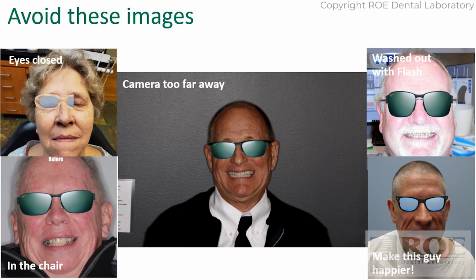Both the top left and bottom left, both the patients are in the chair or lying back. And that just changes the face. It changes because of gravity. It changes the way the soft tissue is being pushed around the mouth. The gentleman on the right, the flash is really washed out. Now I'm being a little picky.